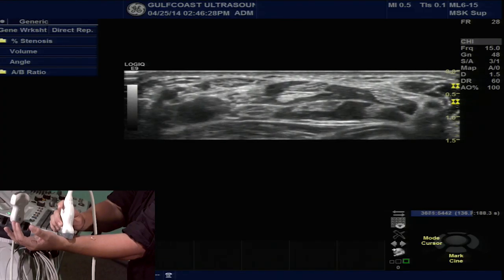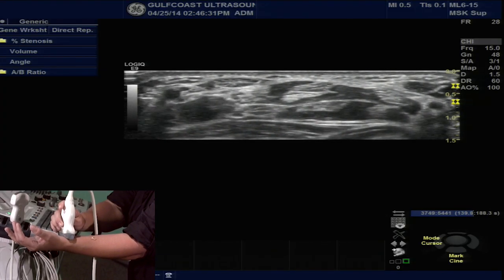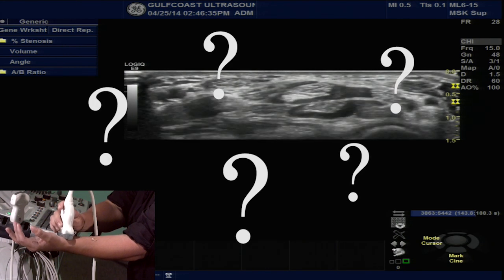Hi, I'm Teresa Jorgensen, and today's Gulf Coast Hot Tip will teach you how to more confidently locate and follow the median nerve into the carpal tunnel. At the level of the wrist, telling the difference between the median nerve and nearby tendons can be very difficult. Can you tell which is which?